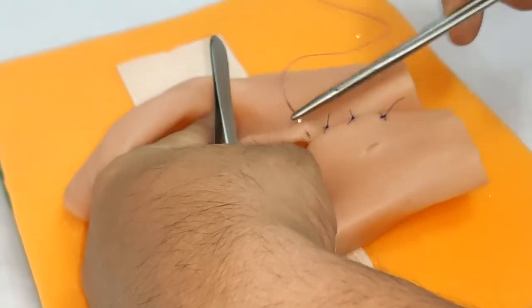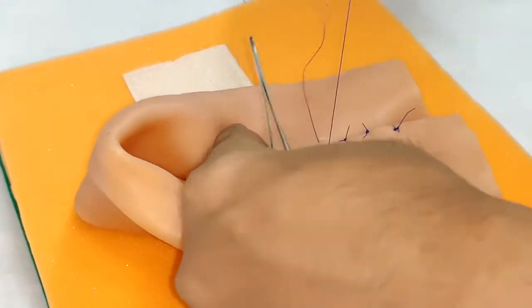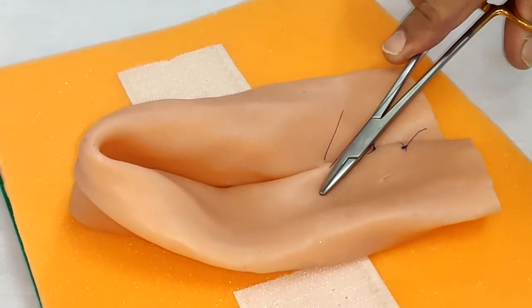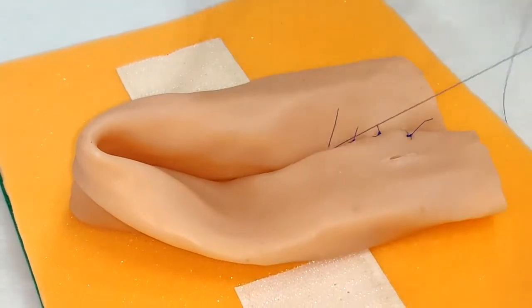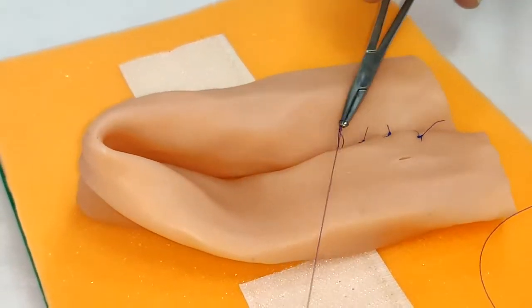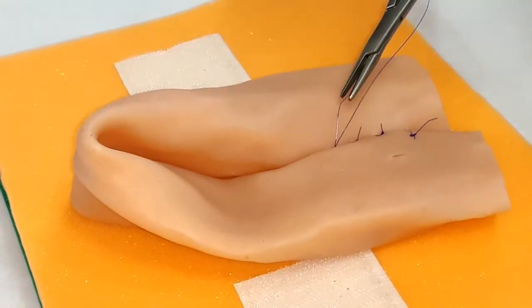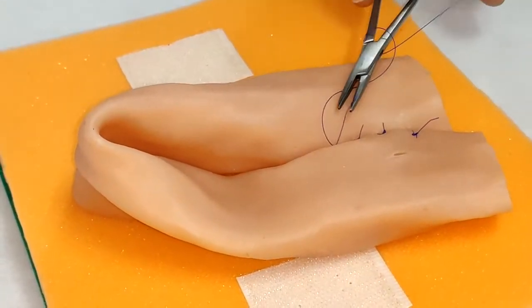These are seromuscular sutures for approximating the two loops. This will also act as a posterior layer of Lambert sutures.